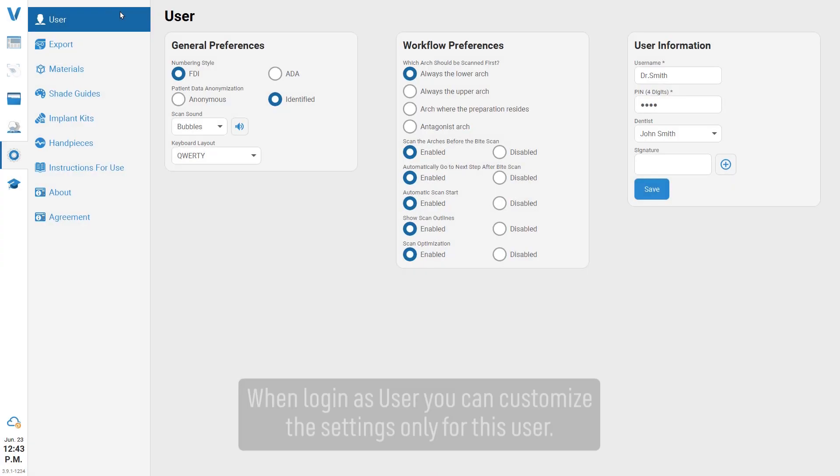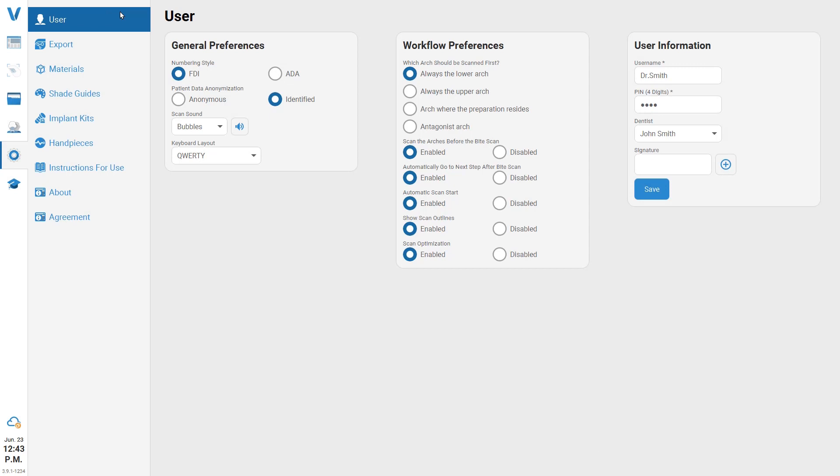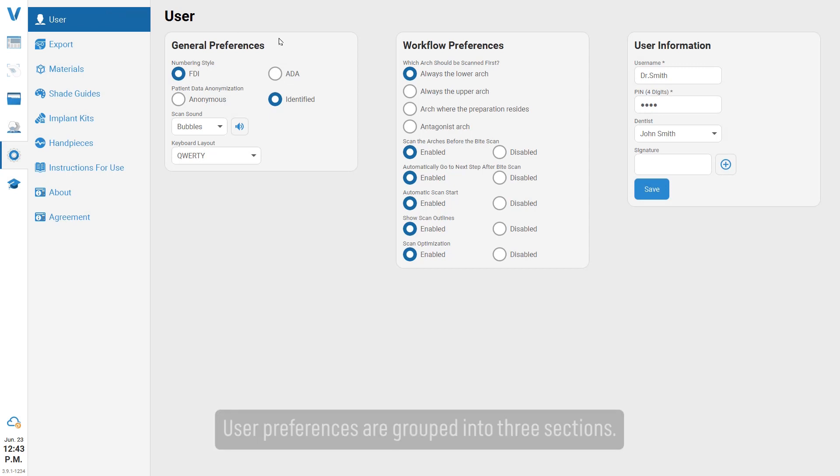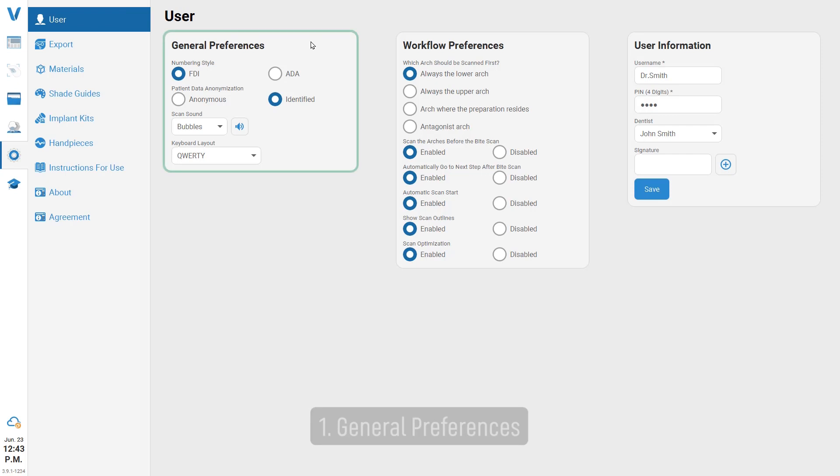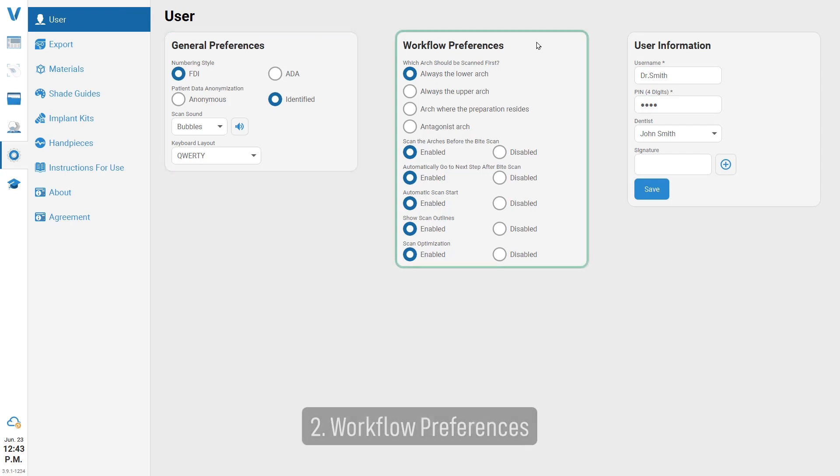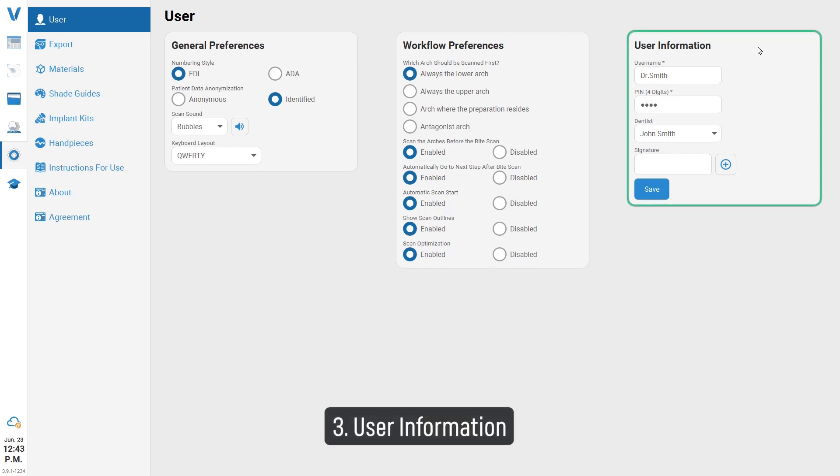When logged in as user, you can customize the settings only for this user. User preferences are grouped into three sections: general preferences, workflow preferences, and user information.